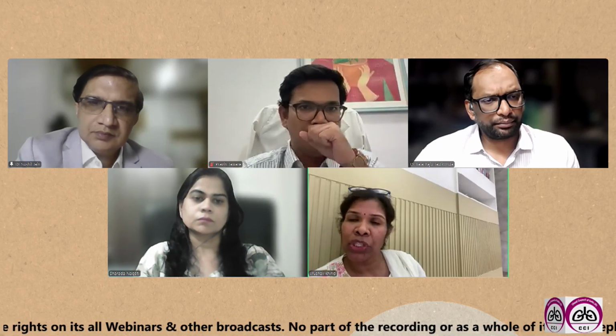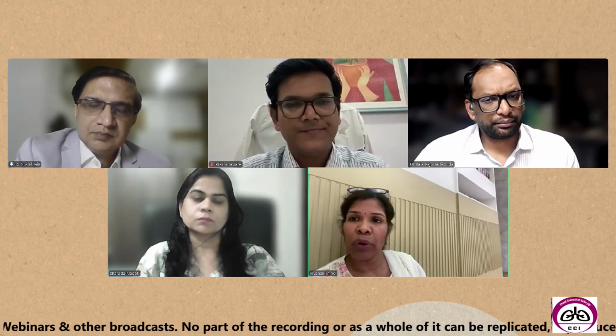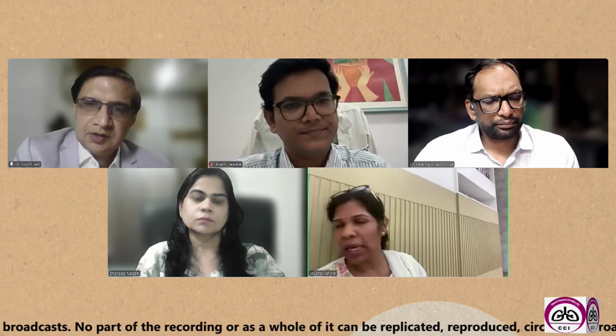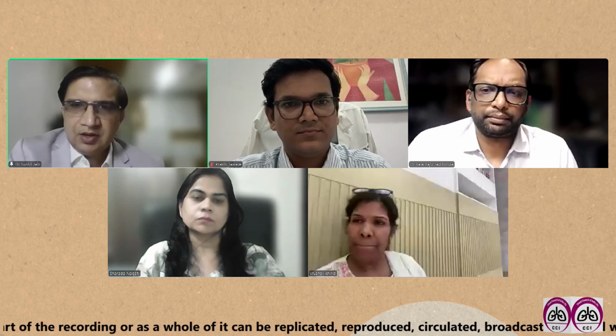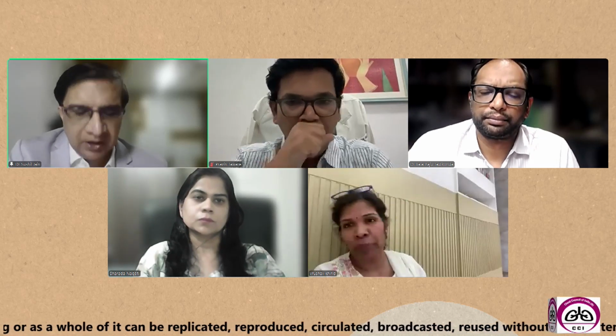So basically, sequential sampling helps increase the yield, and therefore a PET CT is very important when you go in for a malignancy diagnosis. In benign cases, I would really not be in favor of a PET CT. If you're suspecting a benign lesion, we don't do a PET CT. We are talking about malignant cases.